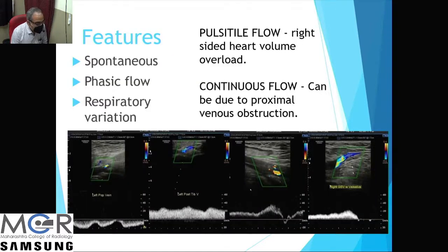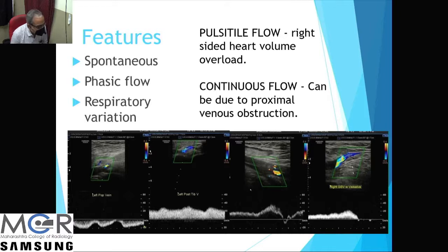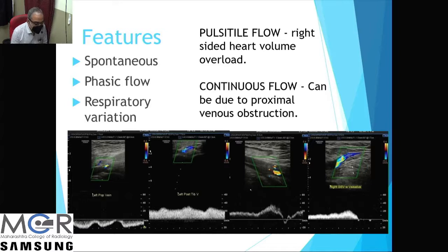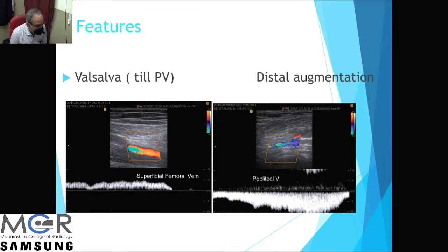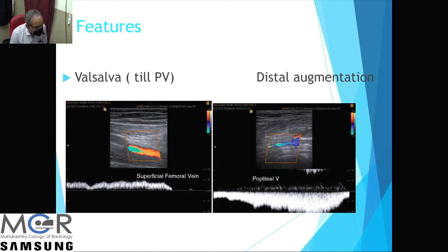The features shown by veins in flow are that it is spontaneous, phasic, and shows respiratory variation. Pulsatile flow is sometimes seen due to right heart volume overload. A continuous flow, like we see in portal venous liver cirrhosis, can be due to proximal venous obstruction. Tests for patency include the Valsalva maneuver and distal augmentation. The Valsalva maneuver can be done up to the popliteal vein level, where increased abdominal pressure will stop flow and confirm patency.